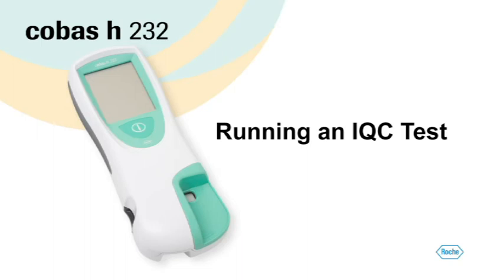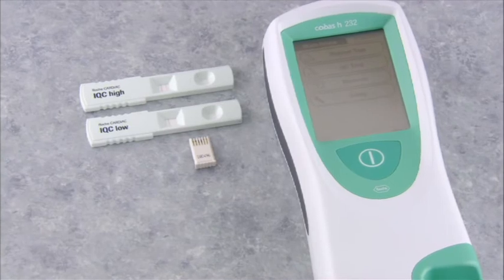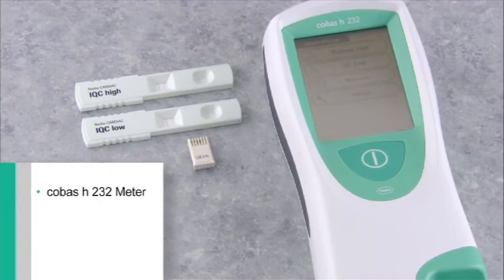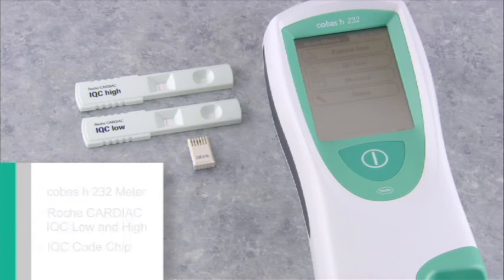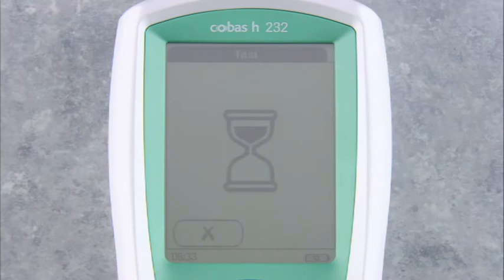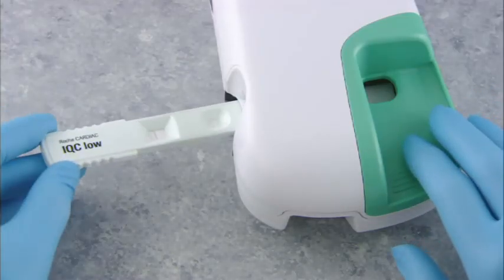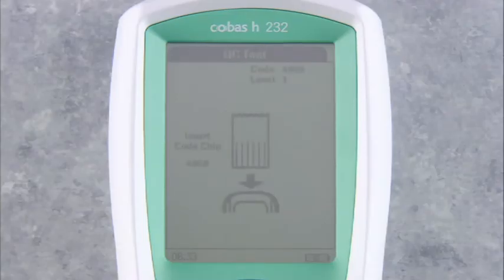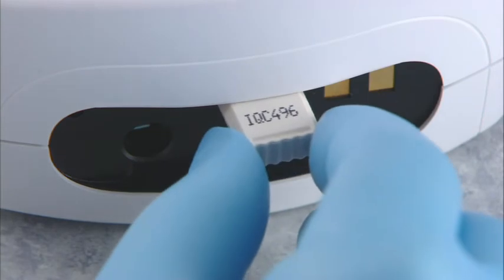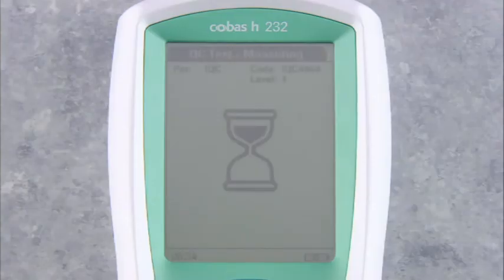Let's look at how to run the IQC. To perform an IQC quality control test, you'll need the Cobas H232 meter, the Roche Cardiac IQC high and low strips, and the IQC code chip. At the main menu, touch the QC test screen prompt. The touch screen shows QC test — insert strip. Insert the IQC low strip into the test strip guide so that the application area faces up, in a smooth continuous motion. If you have not run an IQC test with this lot of strips, the screen shows QC test — insert code chip, requesting you to insert the IQC code chip. Insert the IQC code chip into the code chip slot. Once the code chip's information has been read, the screen shows QC test measuring.